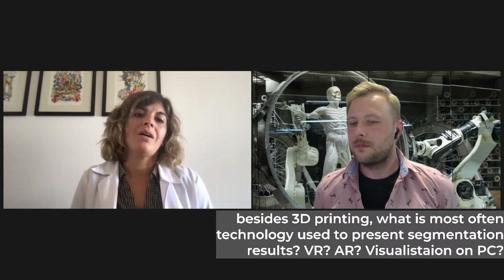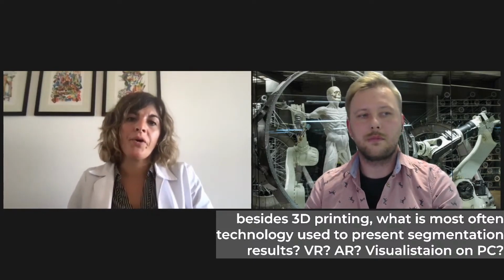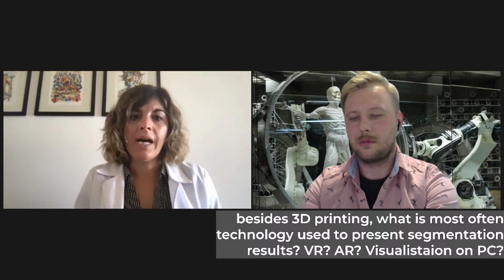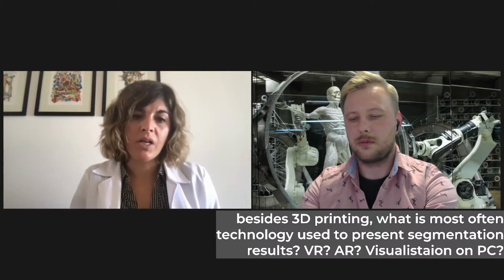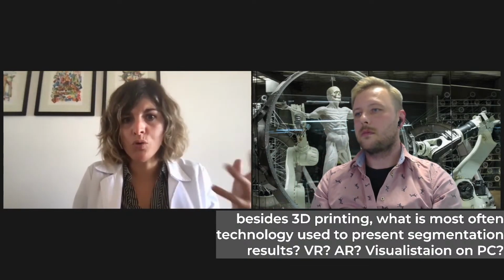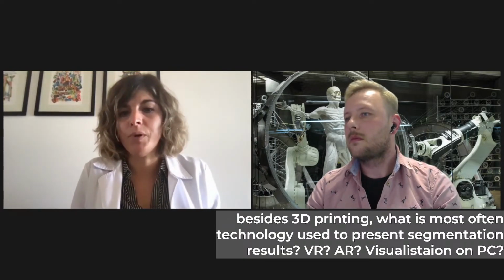And it also means that you have to get the equipment to the surgeon. Whereas if we use other sources, for example, send them the 3D model and ask them to upload it in a 3D navigation software, of which there are many that are free to download from the internet, they can just navigate 3D models on their computer.